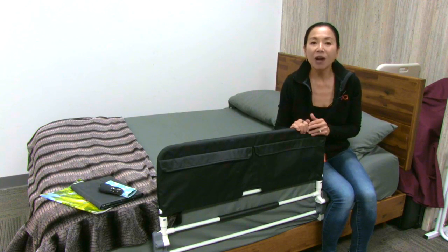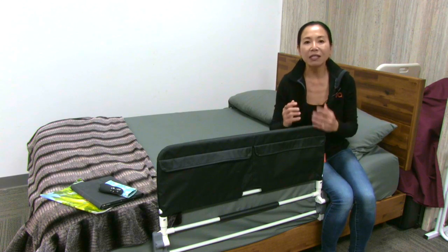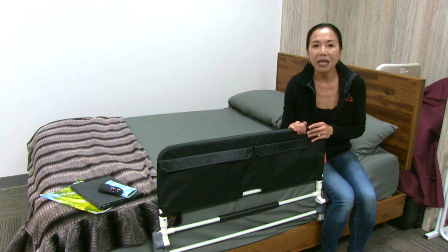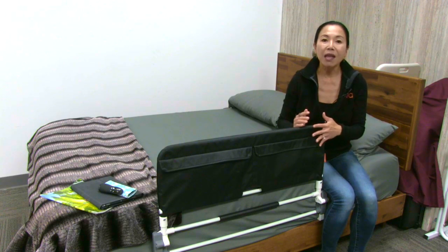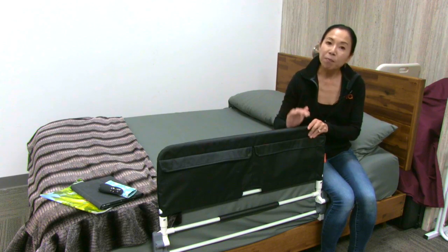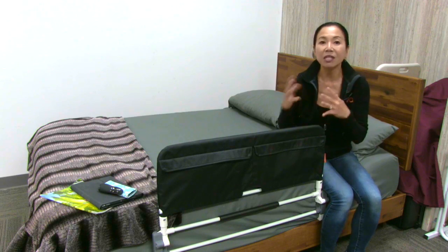At NOVA, we are on a mission to prevent falls. Falls are a leading cause of injury and death for older adults, and most of these falls can be prevented. Most falls happen in someone's home, and many of those falls happen in the bedroom and in the bathroom. Bed rails are a great solution to prevent falls in the first place.